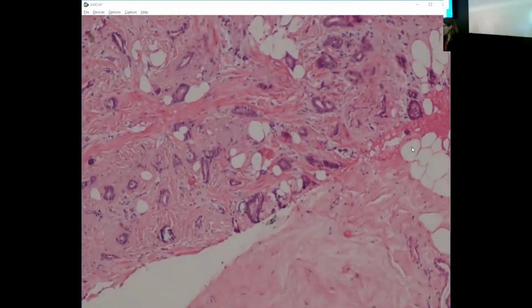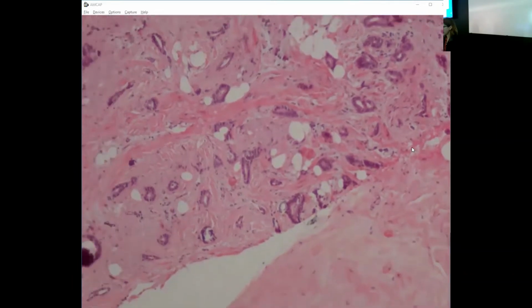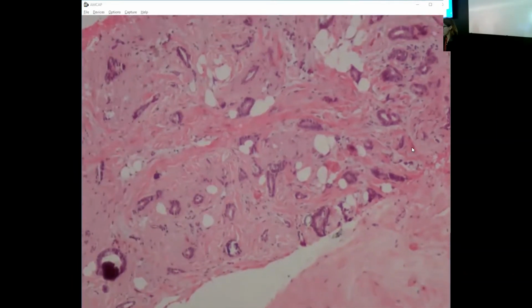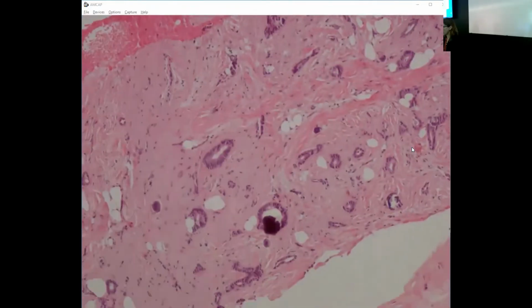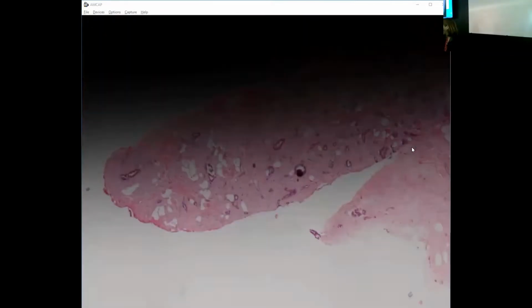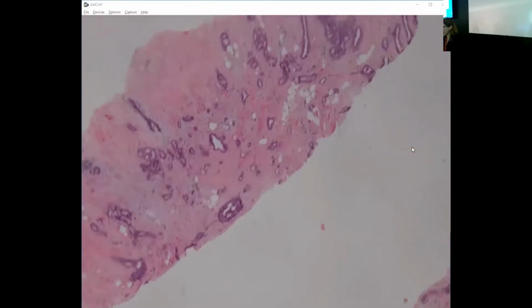As I had in my illustrations in the talk, sometimes tubular carcinomas will have a little bit of an elastotic stroma. So that potentially could throw you off if you're thinking about radial scar or complex sclerosing lesion. But the glands tend to percolate out in between, usually the ADH and low-grade DCIS, if you have any associated with it, beyond what would be in the central nidus of a radial scar or complex sclerosing lesion. So for me, that is the extension beyond the confines.